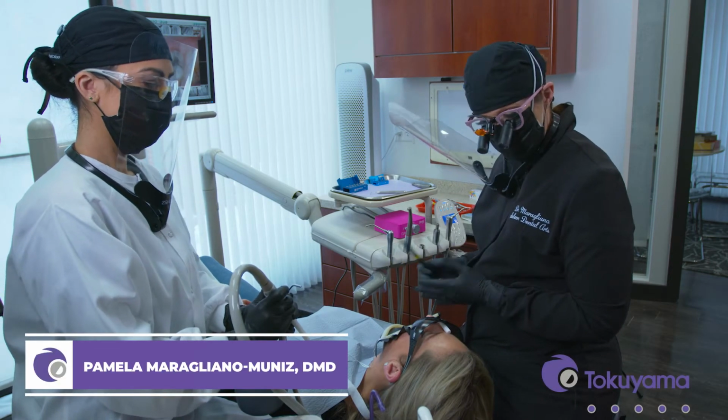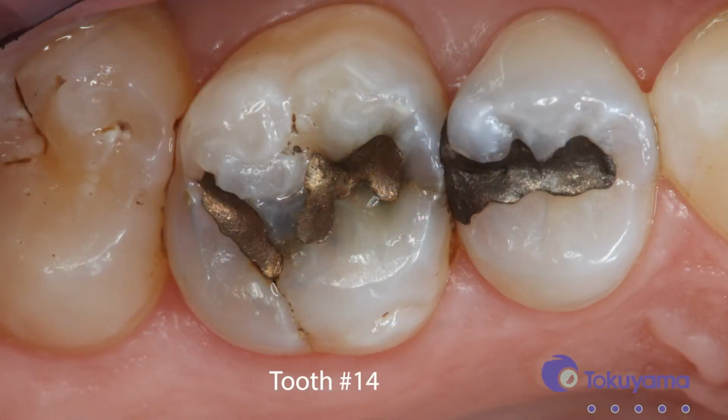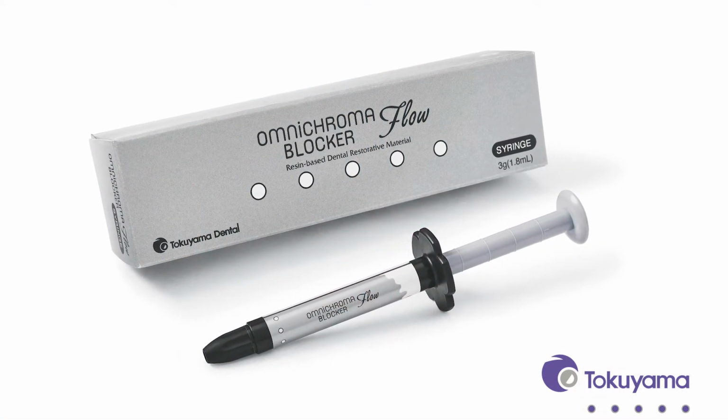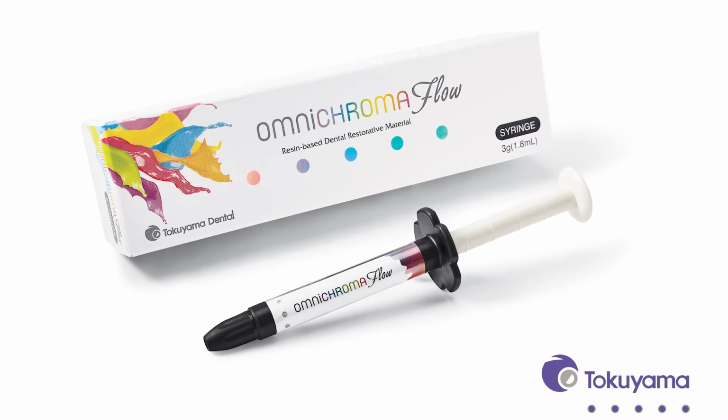We're here with Sarah. She's 39 years old, and she has a 20-year-old amalgam restoration that's starting to break down on tooth number 14. You can see that its cavo surface margins are starting to open up, and there's a subsurface graying underneath that amalgam, so it's time to take it out. We're going to remove the amalgam today, and we are going to restore it with OMNICHROMA Blocker Flow and OMNICHROMA Flow. So Sarah's numb.